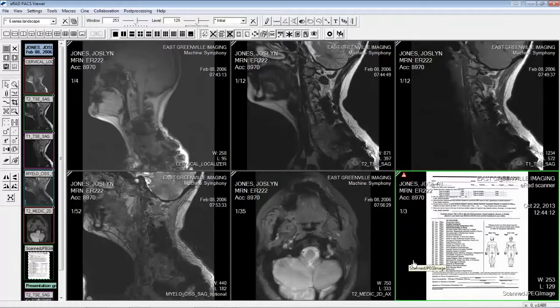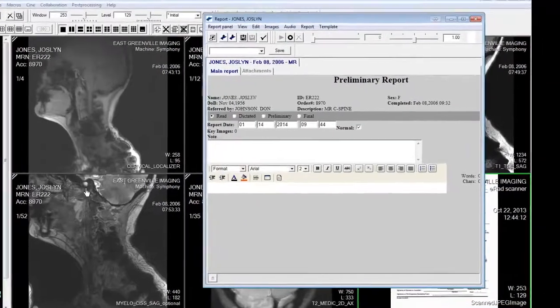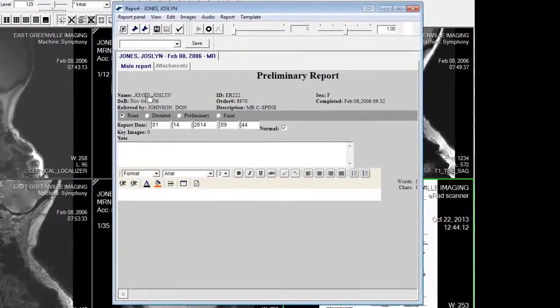The fourth place you can find scanned documents will be in the full report panel in the attachments tab.